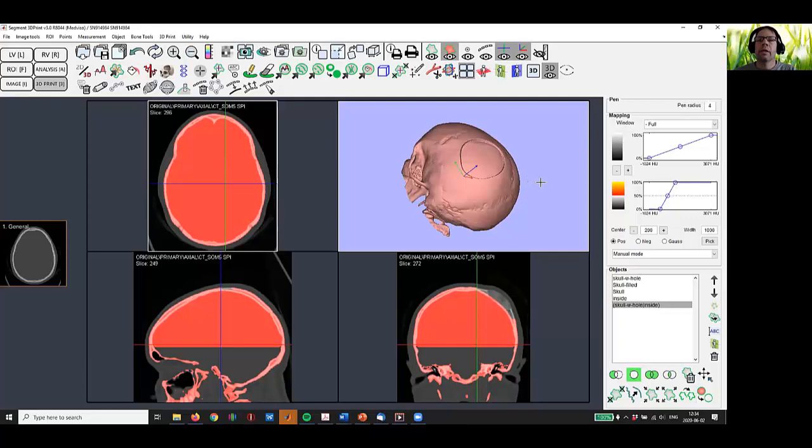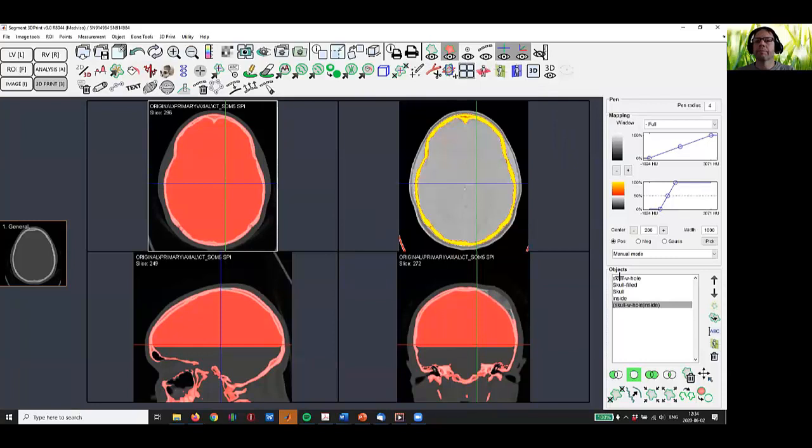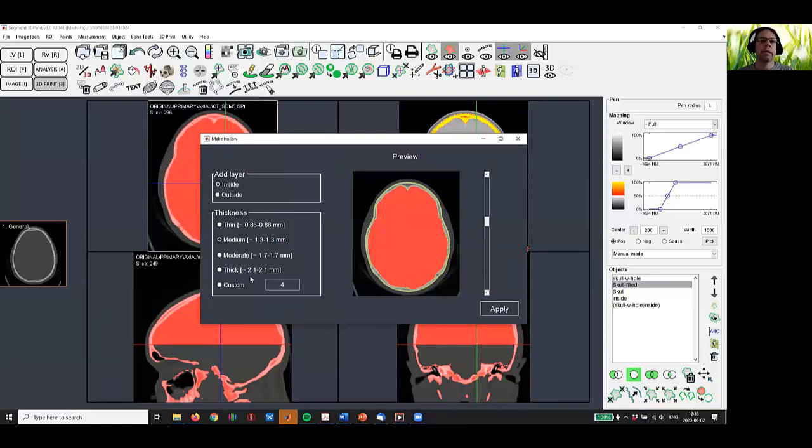Now we want to create a small ring for the surgeons to place on the skull and really see where to open to fit the mold. And then I take the filled skull again. And now I want to create what we can call maybe a helmet. I want to have it, let's say, 6 millimeters thick. I want to have it outside. So now this would be a sort of helmet for the subject.